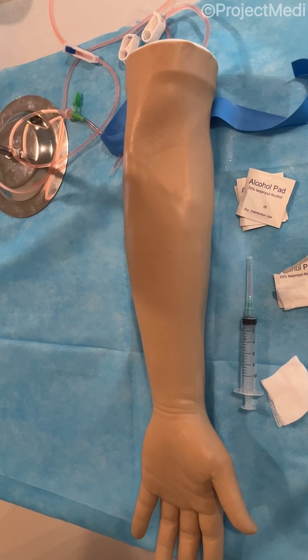In this video, we will be demonstrating phlebotomy techniques and venipuncture using Project Medi's simulation training arm. Please reference our other videos which demonstrate the setup of the IV tubing and arm to prepare it for the venipuncture.